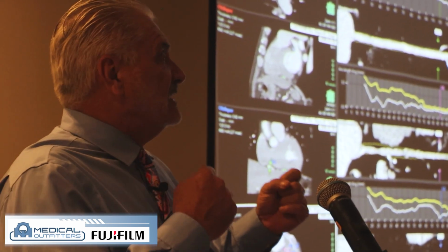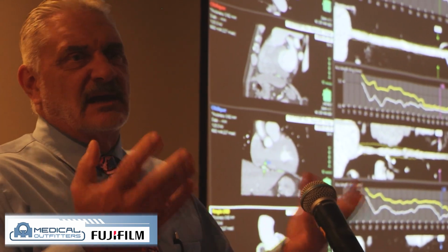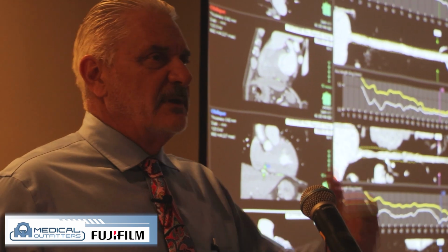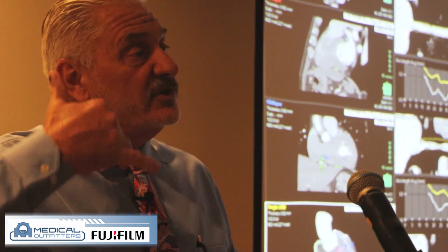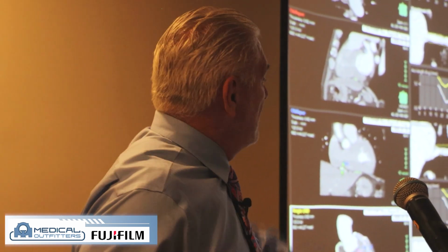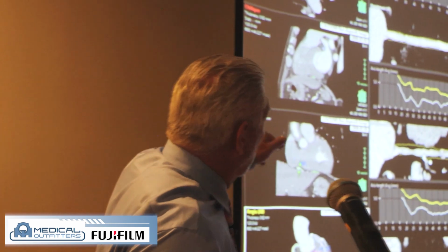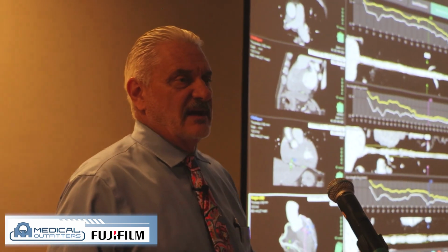So the days of saving a still image are gone. I mean, how many times has a technologist saved a couple of images for you? Go, that would have been great if it had been in the middle and turned a little bit to the side. So I got to call CT and have them do that. So if I can get you 95% of where you need to be by saving a snapshot or a bookmark, which is going to get you where you need to start your read or complete your read, that's the goal that most of the technologists have.